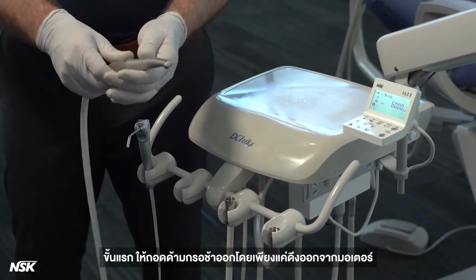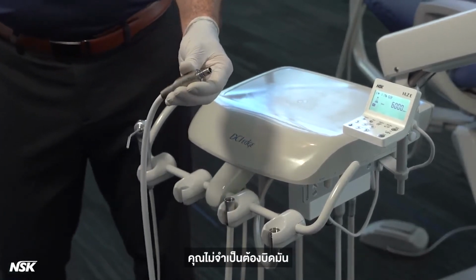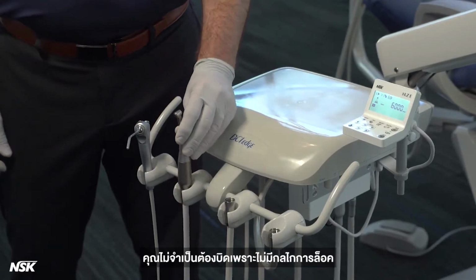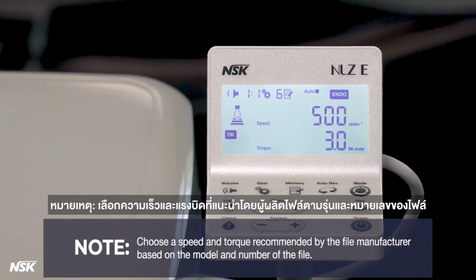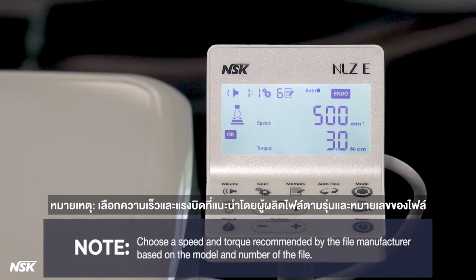First, remove the slow speed attachment by simply pulling it out from the motor. You do not need to twist it. Then, insert NLZ Endo attachment by pushing it in. You do not need to twist since there is no locking mechanism. Turn off the water on the rheostat. Note: choose a speed and torque recommended by the file manufacturer based on the model and number of the file.